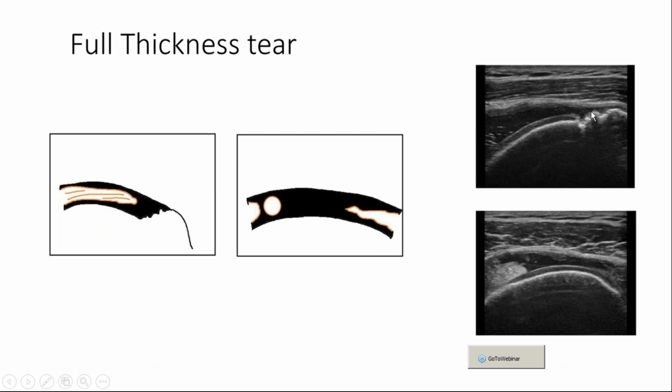And this is all effusion. You know this is effusion because you see the cartilage interface sign here, right? So after you address the tendon issue, you write about other surrounding interfaces like the bony interface, cartilage interface, and the fluid in that region.